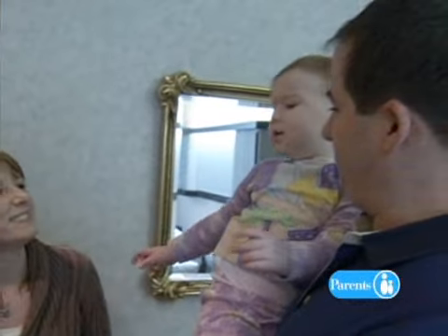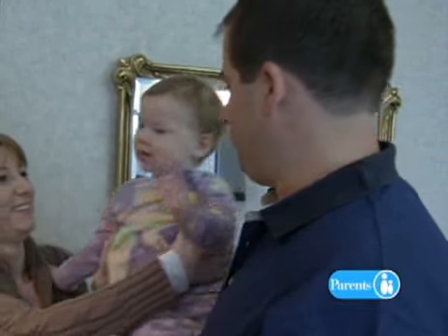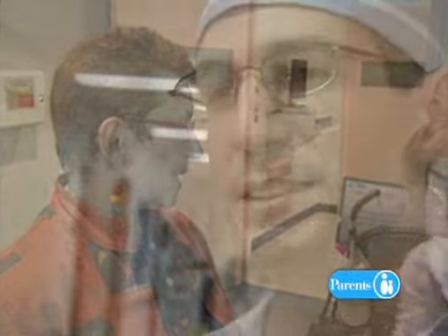Do we have a turn-on date for her? Yes, we do. March 25th. Yay! We're going to turn on 2 ears. You're going to get your second ear on March 25th. Pretty exciting. 99% of children with hearing loss can be helped with a cochlear implant. The 1% that cannot are children who have such a severe abnormality of the inner ear that you can't really get a cochlear implant into, or they don't have a nerve of hearing.